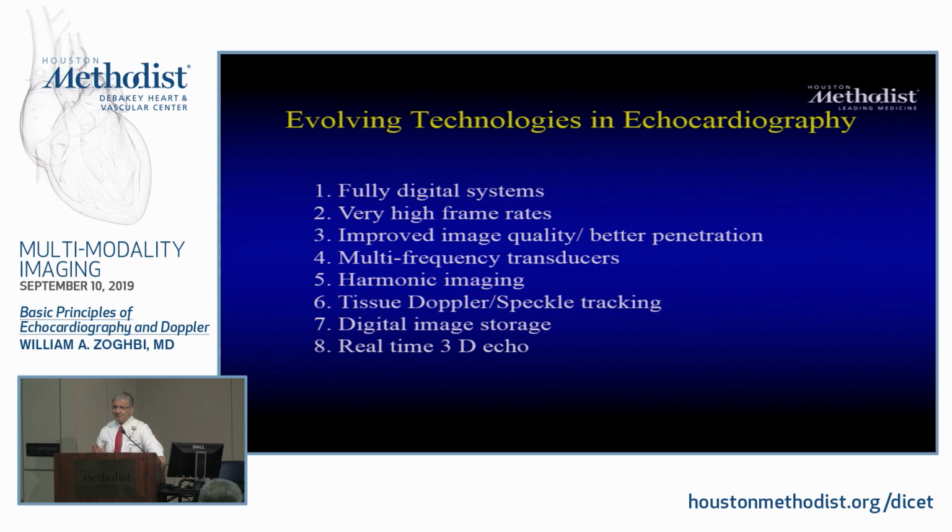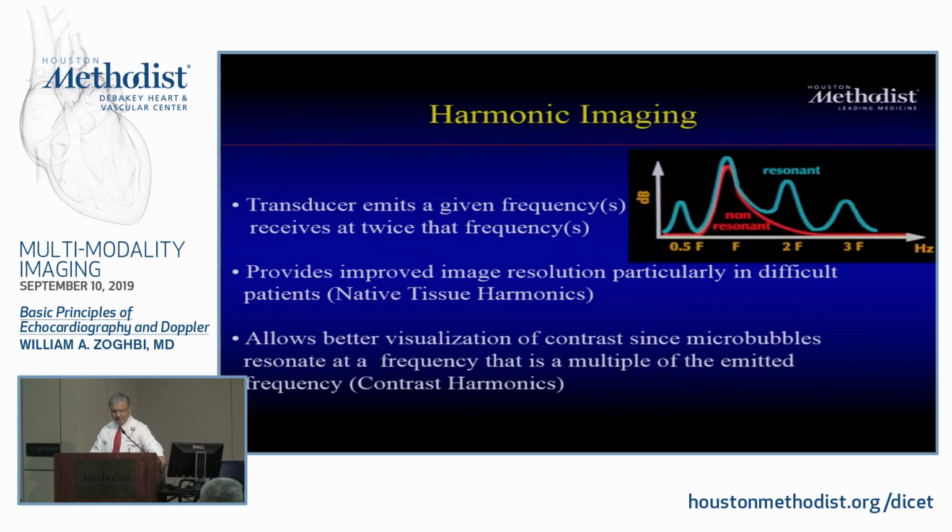And the amazing thing to me is all the computer and digital technologies that have improved over time. The principle is exactly the same. It's the piezoelectric crystals that send ultrasound in the megahertz ranges, right? For practical purposes for us, between 2 and 7.5 megahertz or so. And you get this reflected signal, and it's up to you what you deal with, and how you improve on it. And it really has been amazing.